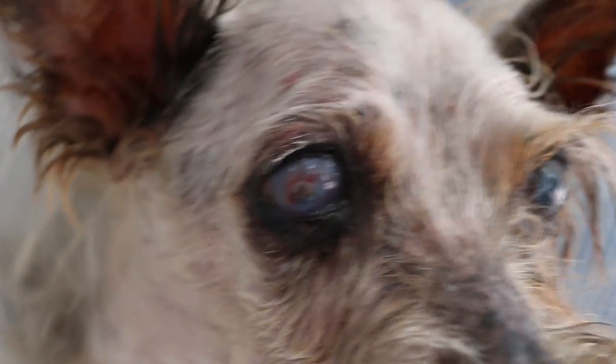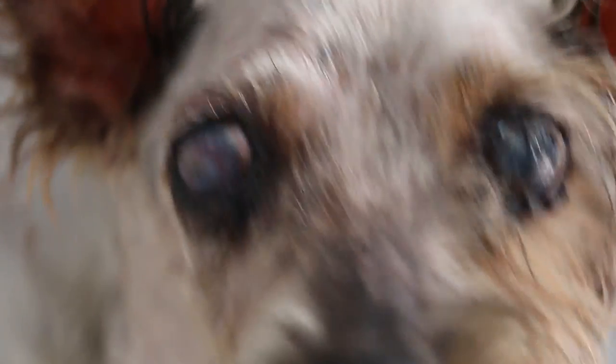You can see the cornea. The central deep cornea is also healing up. The white tissue is scarring. The ring of vascular, even the blood vessels bring in the healing cells.